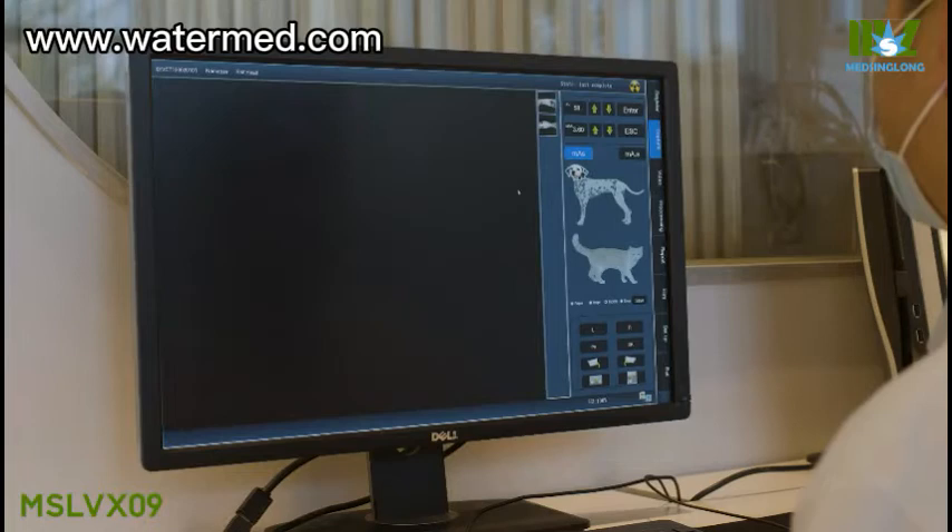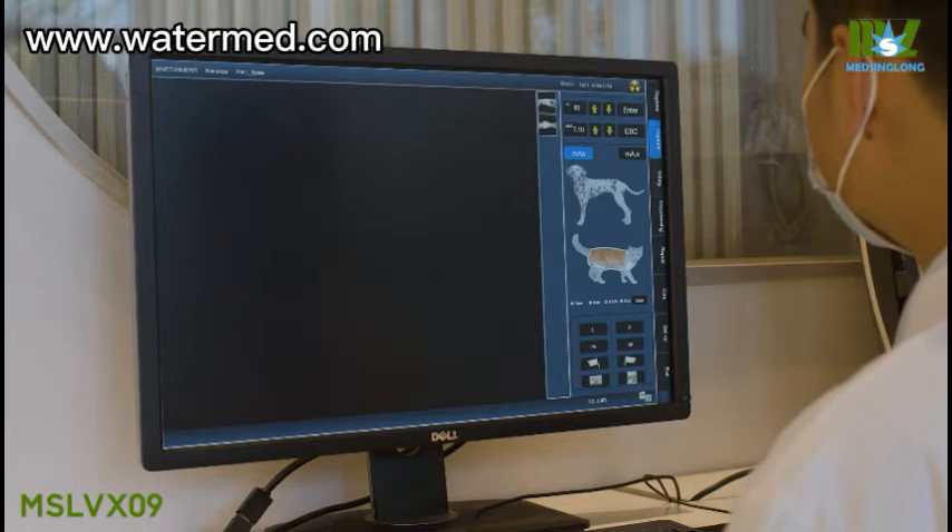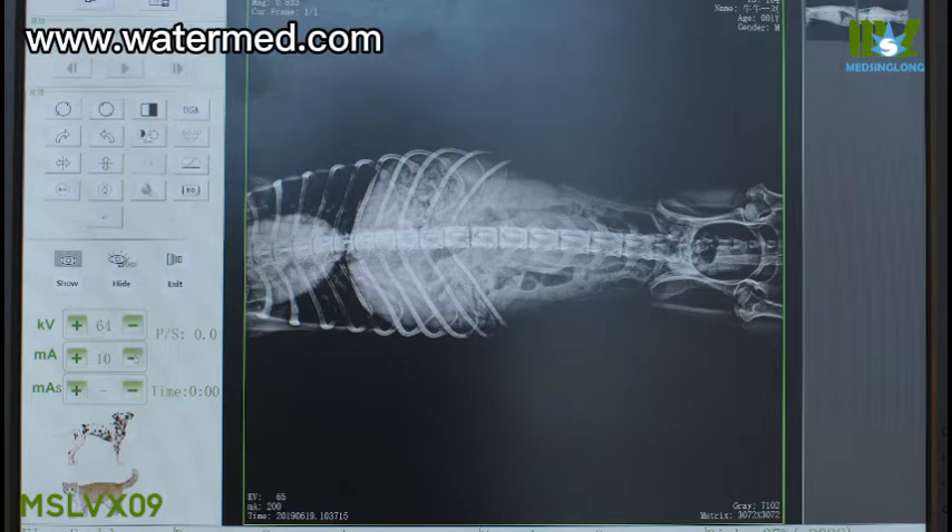A specially designed veterinary-use software supports both static images and dynamic images. Our digital workstation can support patient registration, image collection, image processing, and case report printing.